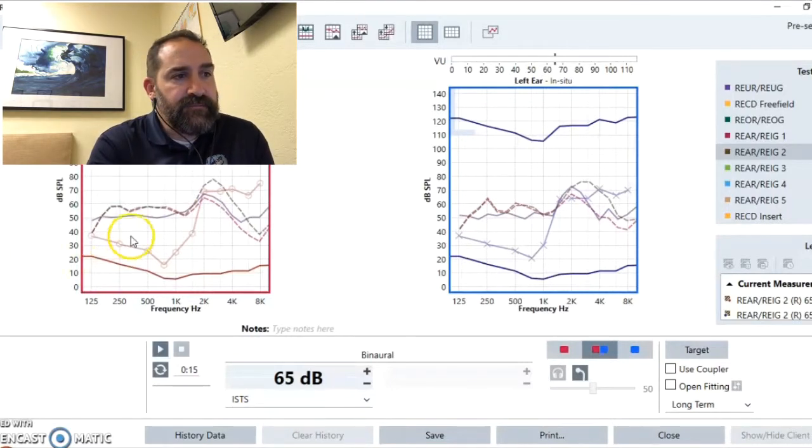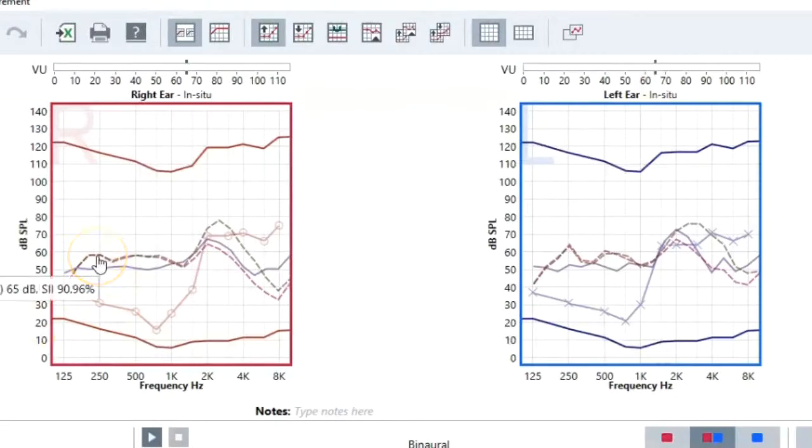Now we see the difference. At these lower frequencies, there is no difference in amplification with the hearing aid on or off. But when we get to the mid frequencies, that's where we see the difference — here's off, here's on. With the hearing aid off there's 60 decibels; hearing aid on, that sound is getting amplified to nearly 80 decibels. That's a really big difference — nearly 20 decibels of amplification, which is a very significant difference.